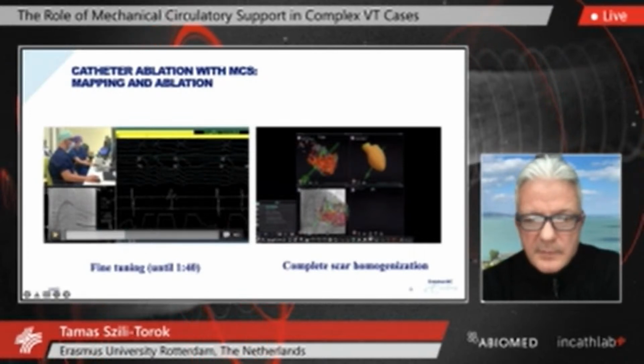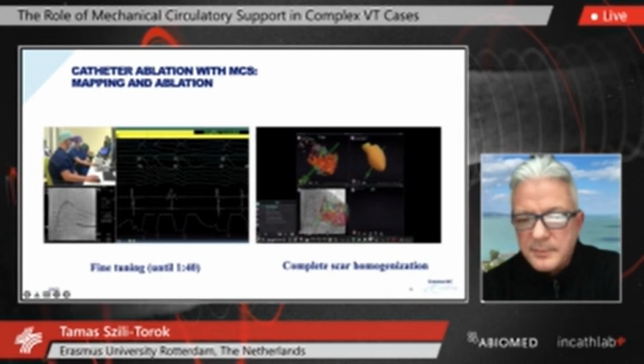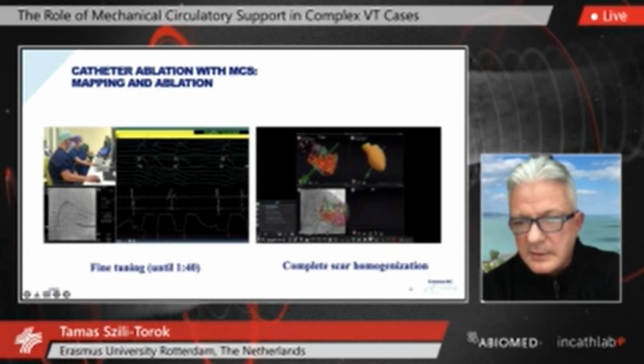On the other side, what you can see is the end result. This is a combined approach. So we tried to do the ablation during VT. And in this patient, we had 5-6 VTs, and we always re-induce. We have the Impella, so it's very safe.